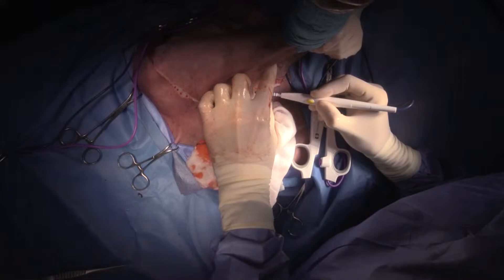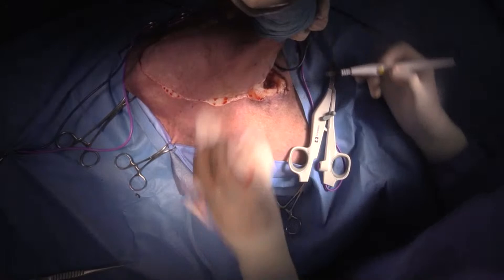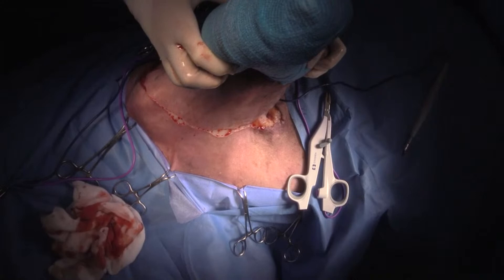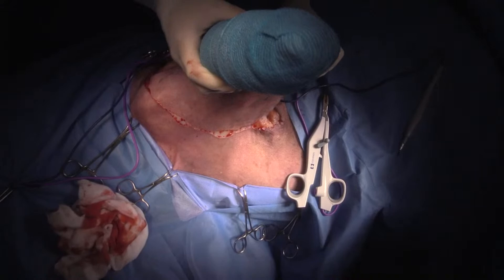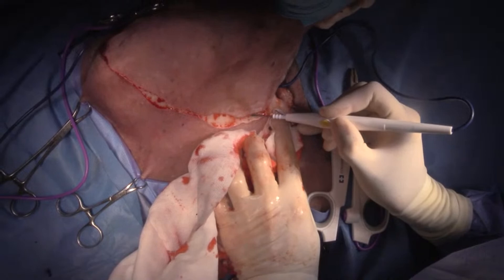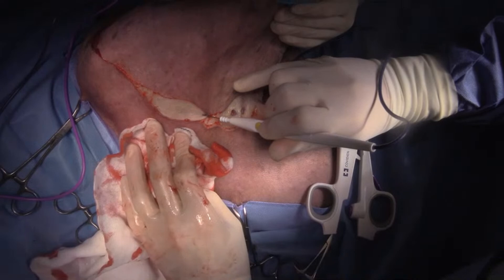We're going to start going through the pectoral muscle now, working more in the center. I'll get you to zoom in a little bit. We'll get a lot of twitching here just because the pectoral muscle is so big. Some people will give them atracurium to keep them from twitching.